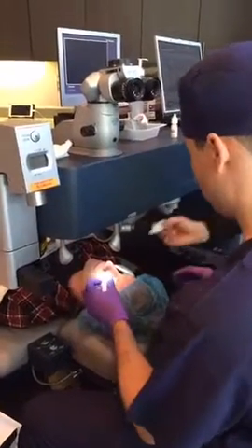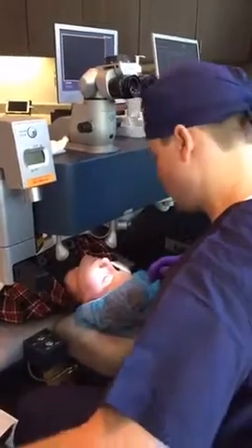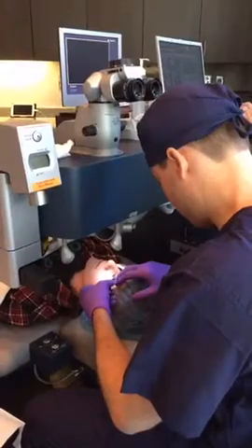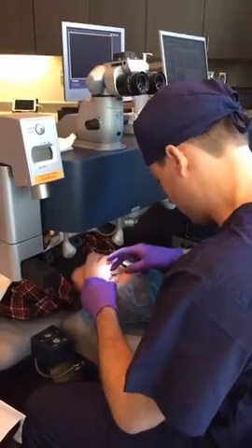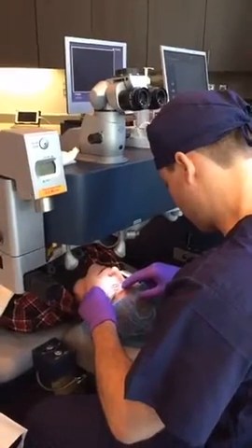So a couple more anesthetic drops now on your left eye. And then just looking straight ahead, you'll see that green blinking light up there. It's your eyelid holder once again. Sometimes that's the weirdest part. So if you can find that green light for me, I'm going to move it over to here to see.